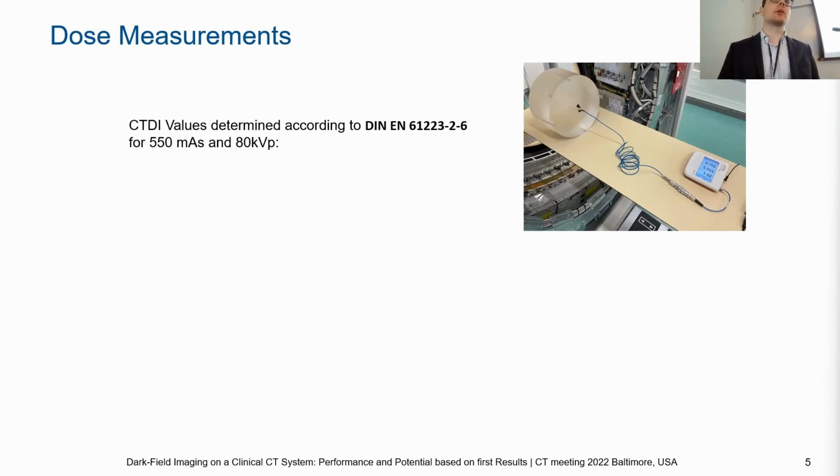Our system does not allow going lower than 80, so obviously we couldn't test it. What we did test was going higher, and there, from my experience, it is not that helpful to go to higher voltage numbers.